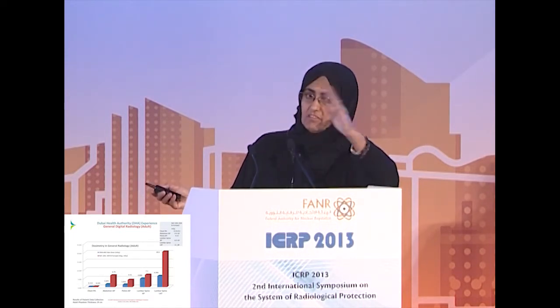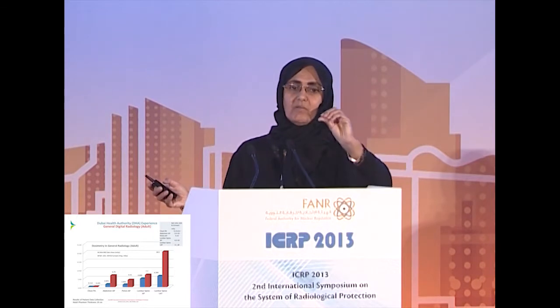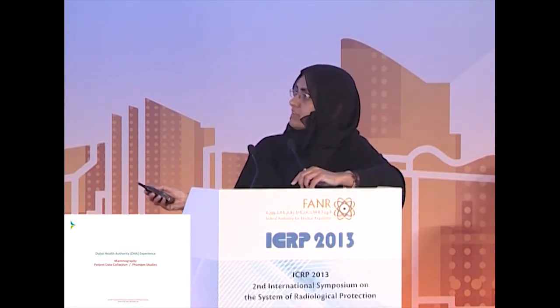I mean, calculated is the displayed dose, which is measured by the system. Here is the data on adults, and we compared our data with some published data. The values we found are much lower than some other published data, but we are not saying that these are final data, because the sample we used is small, so we are still in the process of looking into more data.